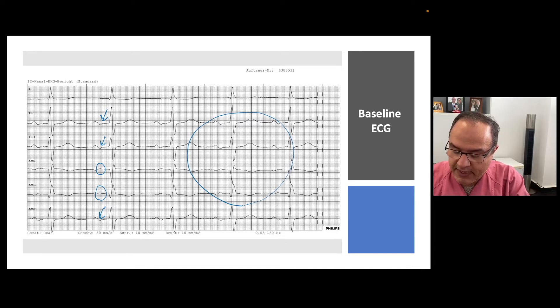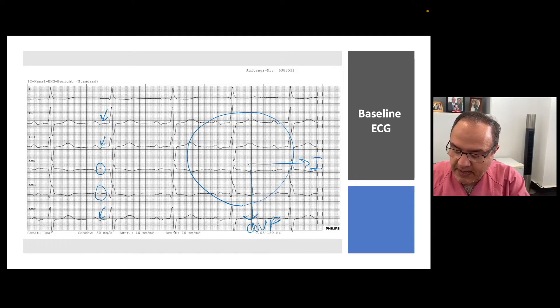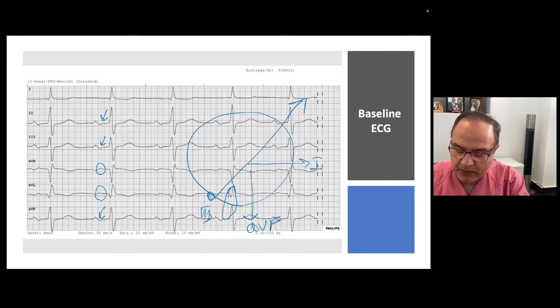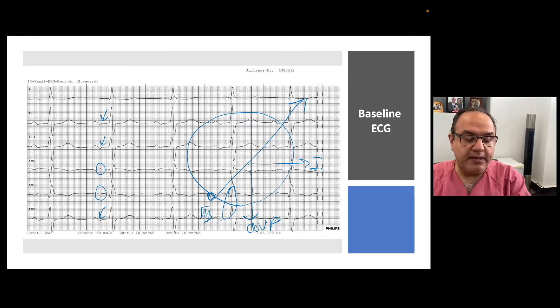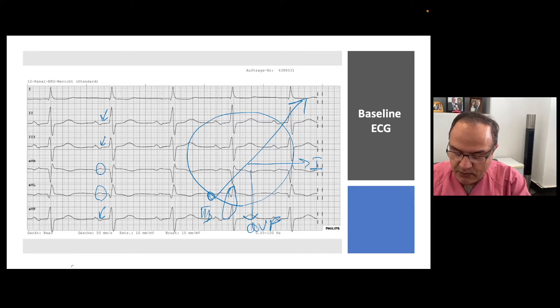When we look at our ECG, here is lead I and also AVF, here is lead III. The CS ostium is responsible for why lead III is the most negative and AVR is the most positive. This finding is most compatible with Bachmann bundle block.